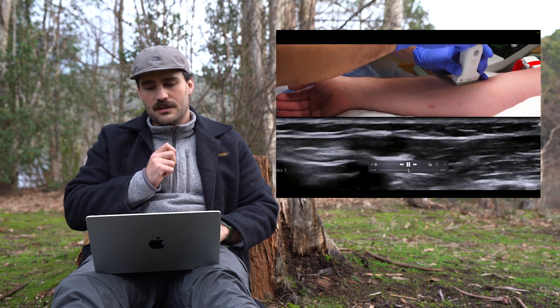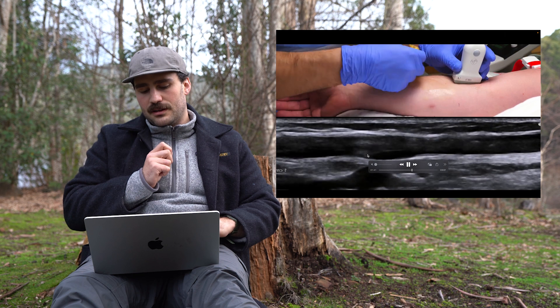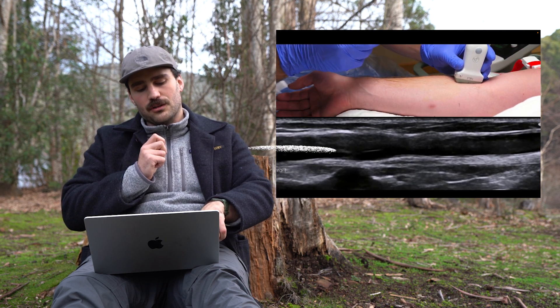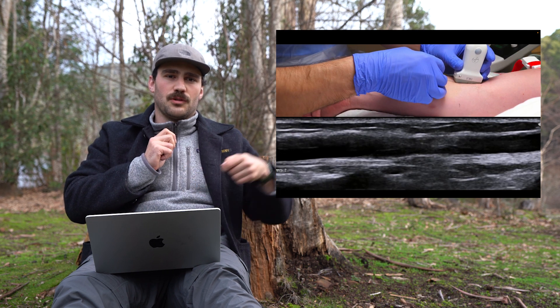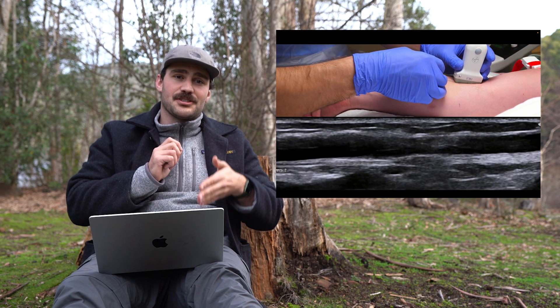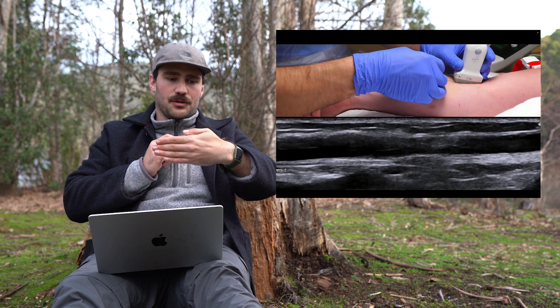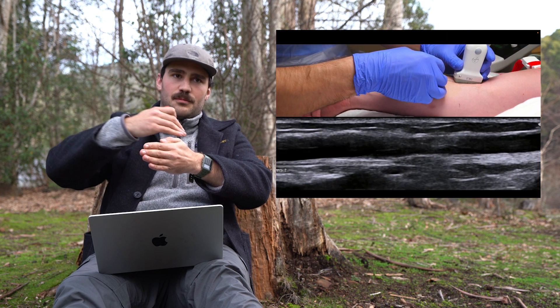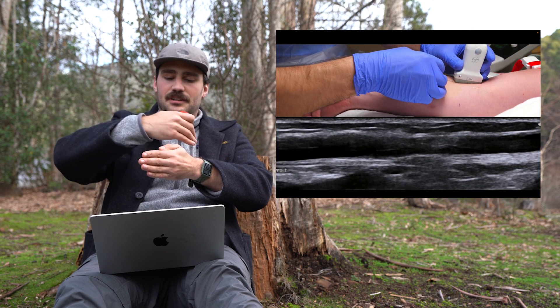If you notice, they rotate the probe so it's lengthways — along the same axis as the arm. Now we get a good idea of how the vein runs. We've got a long black rectangle instead of a black circle. That's really important because we don't want to just put the drip into the circle and have it go left or right outside the vein — we want to run the cannula along the course of the vein. So if I see the vein as a big circle and then rotate it to see it lengthways, I'm going to insert the cannula along that same axis. That's how you make cannulation successful.